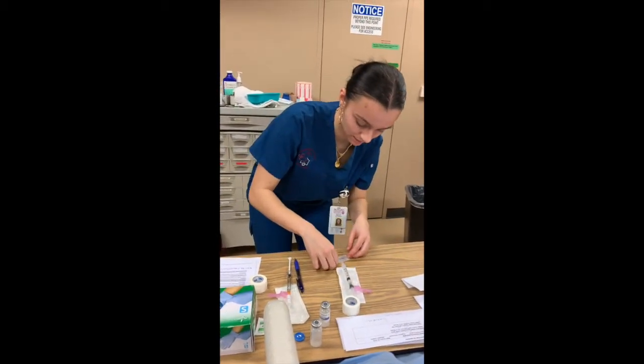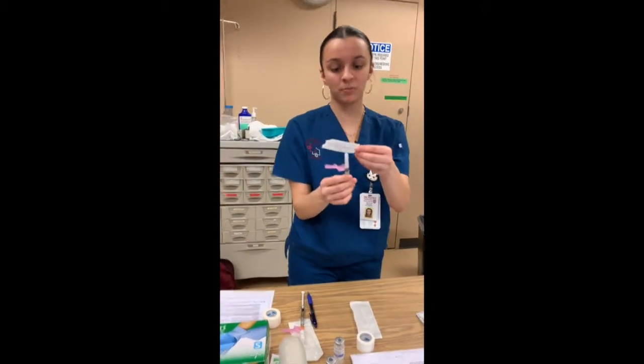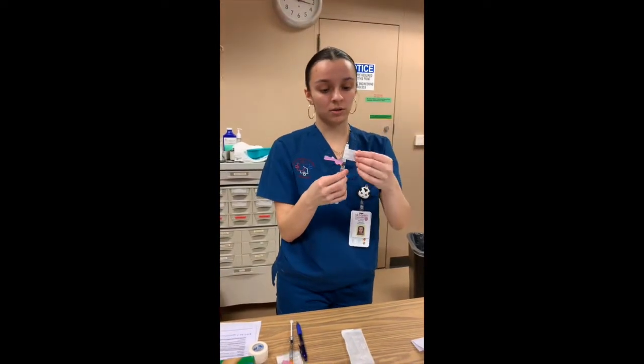So now I can take it. What I'm going to do, I'm going to do the same as I did for the subcutaneous one. I'm just going to put it around the cap for identification. Okay, so now we can actually get started with the injection.